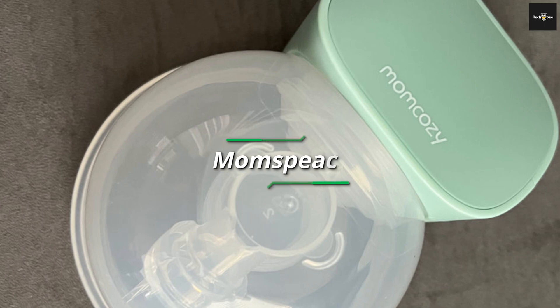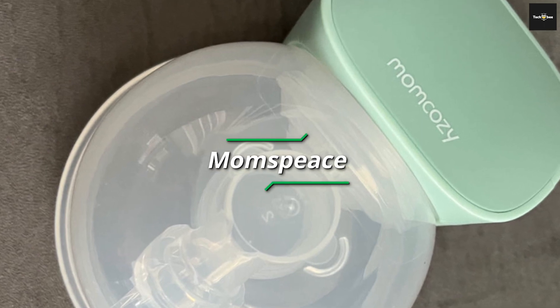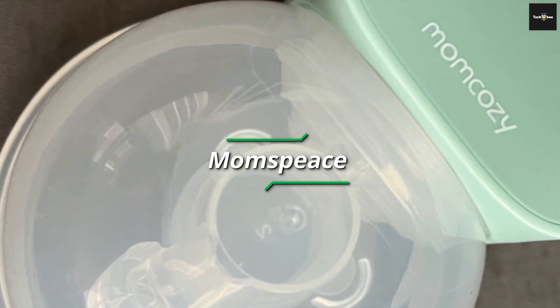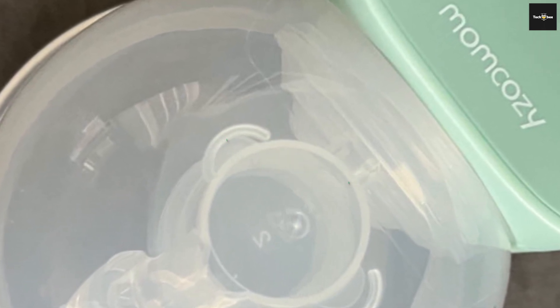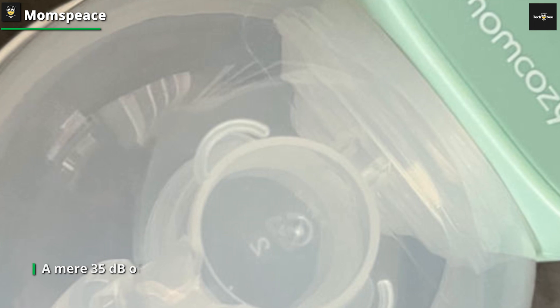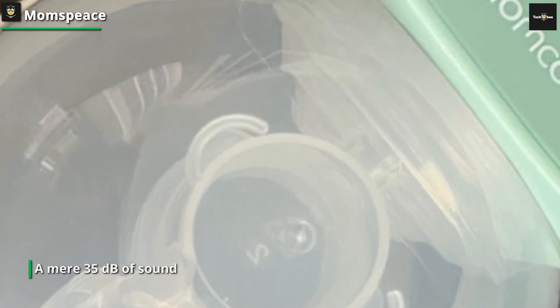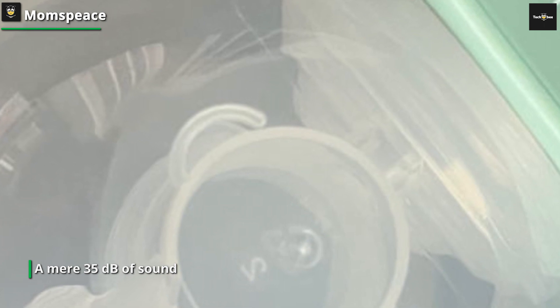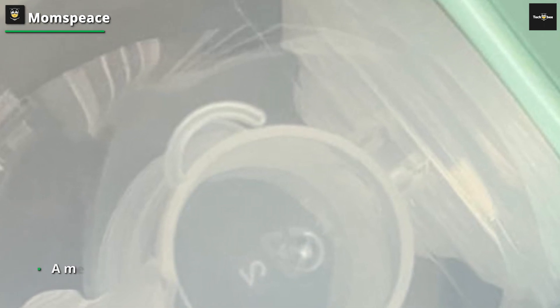Momspiece hands-free breast pump is meticulously crafted for contemporary mothers constantly on the move. The accompanying smart app empowers you to regulate the pump seamlessly from your phone, facilitating adjustments to suction levels, monitoring pumping duration, checking battery life, and more — all without delving into your attire.